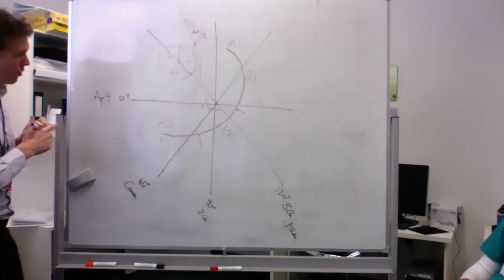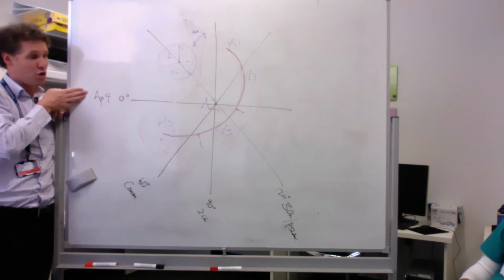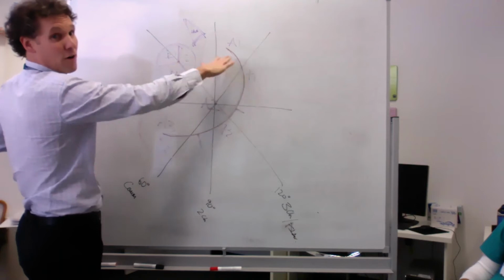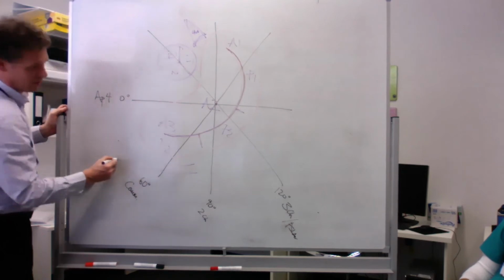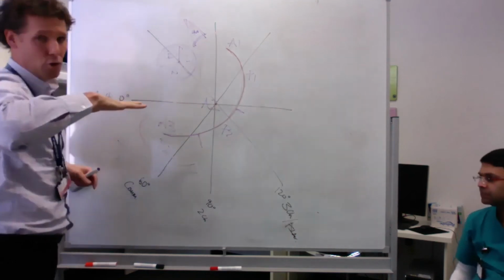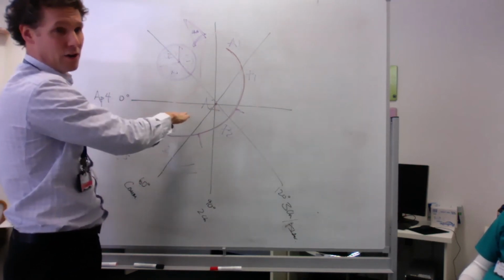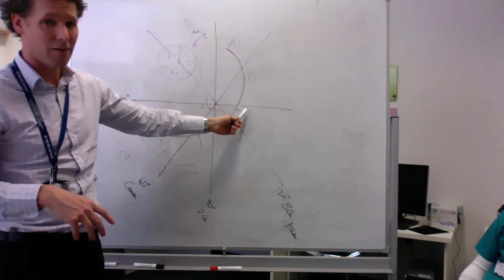So if you're on a TOE or on transthoracic, in your apical 4, you can pick up whether it's anterior or posterior quite easily. And then by fanning up and down, if we fan up, we get our 5-chamber view, and if we fan down, we get our coronary sinus. Is everyone with me? I do find this quite challenging. So apical 4-chamber view, fan up, 5-chamber, fan down, coronary sinus. And that helps tell us if we're dealing with the anterior leaflet that's prolapsed or flail, or it's a posterior.